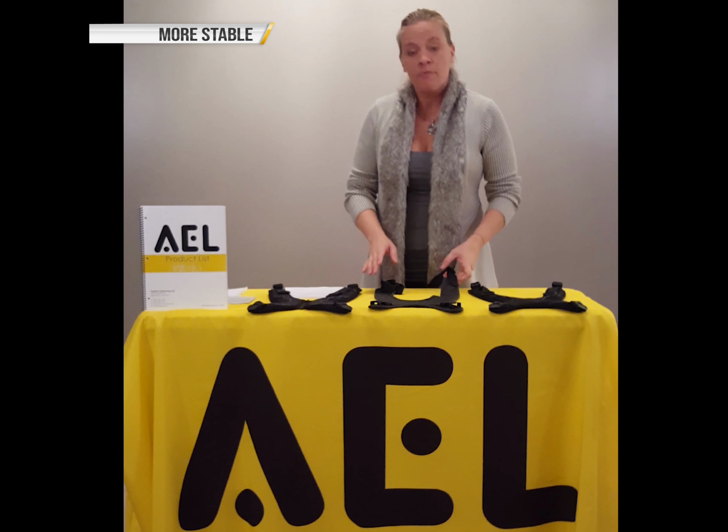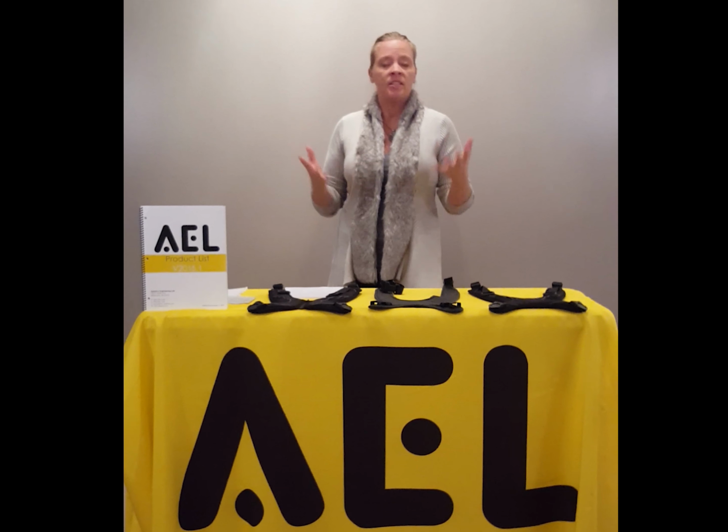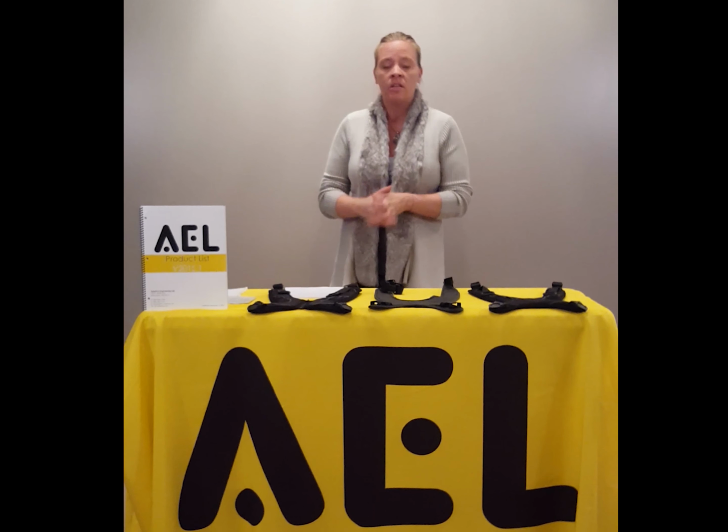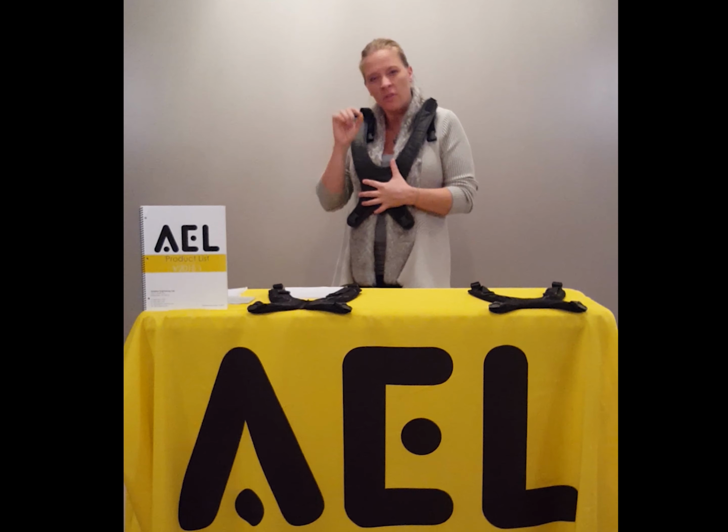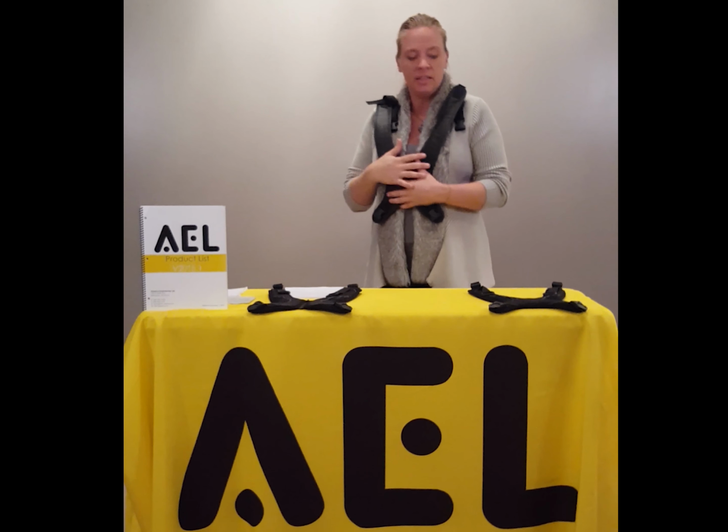This may be needed for clients who have a diagnosis such as cerebral palsy, or a diagnosis where writhing motions are present many times, or if you have a client who's very mobile in their seating system and you don't want them to have that mobility. You'd rather they be very structured and very secured in their seating system, without the opportunity for repositioning or for flex or for the minimal amount of adjustability that the stretch offers.